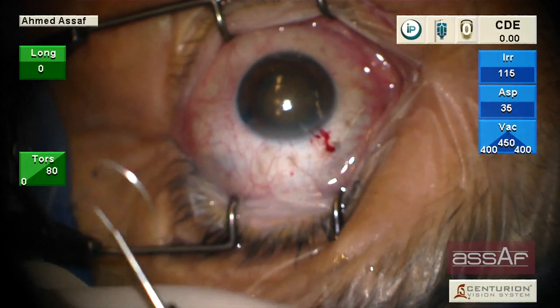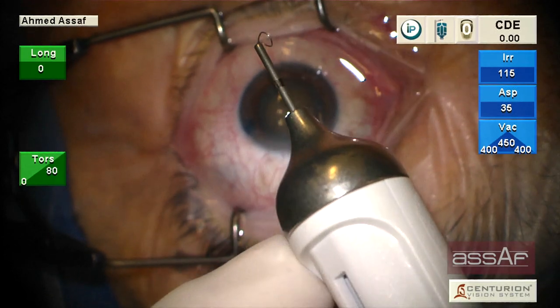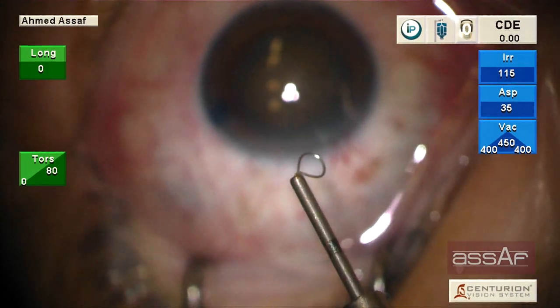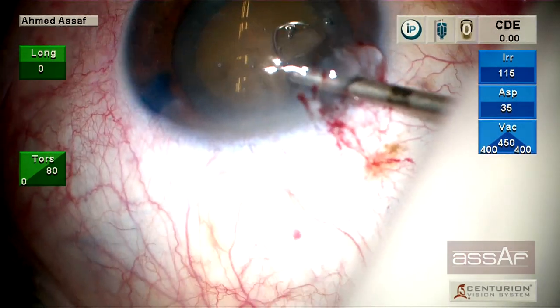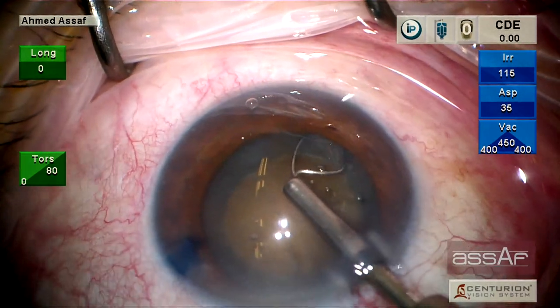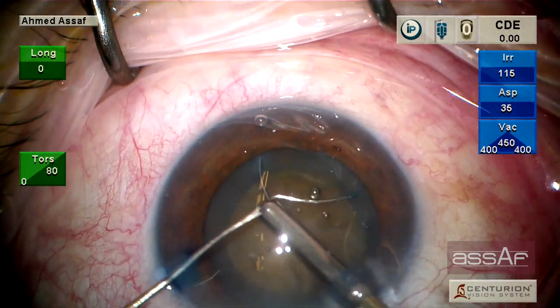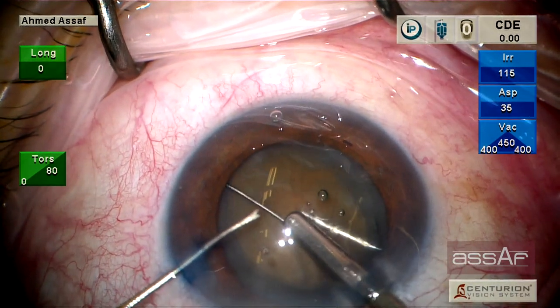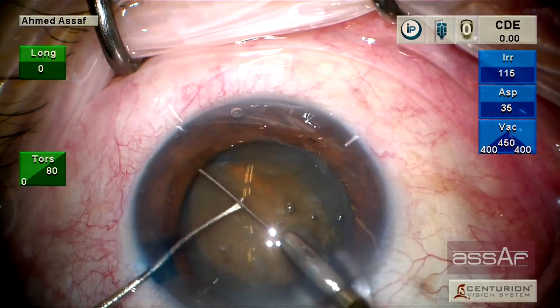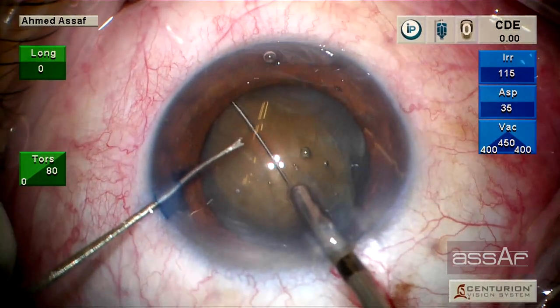I don't have any financial interest in this product. By retracting the lever backwards, we can retract the loop to introduce it through a 2.2-millimeter incision. I don't do hydrodissection in this case — that's not necessary in my opinion. Now we can advance the lever so the MyLoop will expand inside the eye between the lens capsule and the cataract. You can see the silver reflex underneath the lens nucleus.